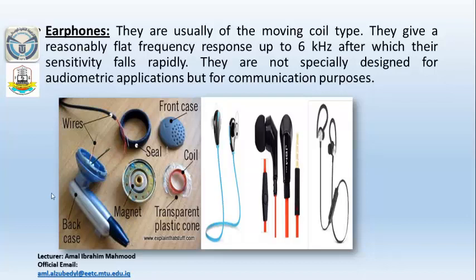It may be noted that audiometric earphones are not interchangeable and must remain identified with a specific instrument to preserve the calibration. In conditions where ambient noise is too high for unshielded earphones, specially designed audio cups are used to exclude background noise, which would otherwise result in elevated threshold measurements.